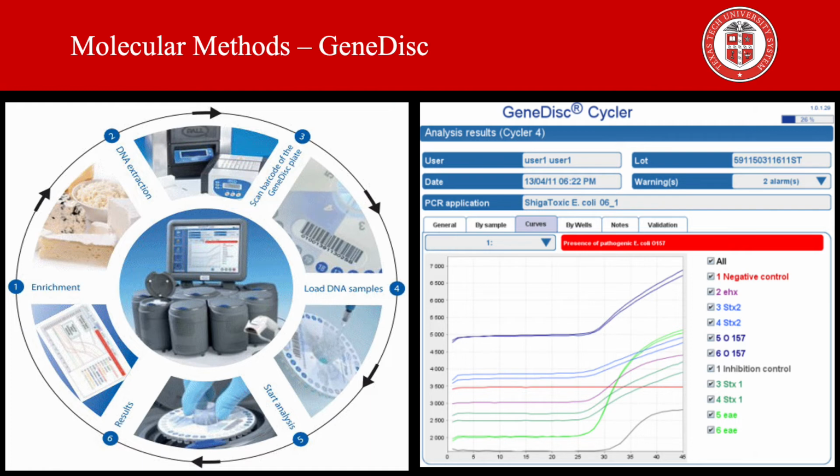The cycler performs gene amplification in the plate, and each plate can be used to test either 6, 9, or 12 samples in parallel. When all subunits are in use, the cycler can analyze up to 96 samples in 1 hour.